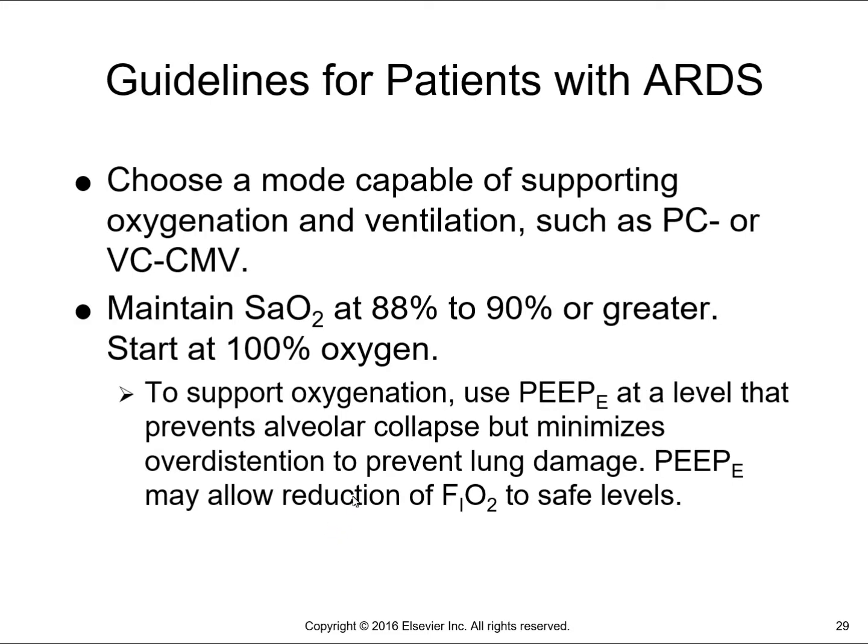So with ARDS, most likely we want to make sure we're able to oxygenate and ventilate the patient. You can go pressure control or volume control.